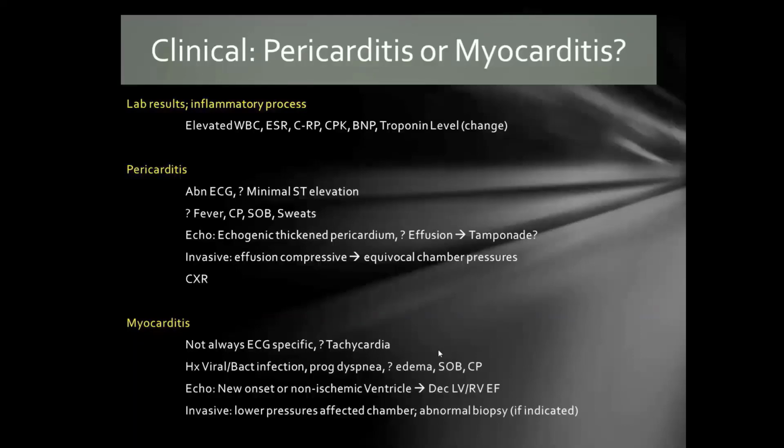And of course, we want to look for effusion, if there's anything in the effusion, debris, and of course, if there's any RV collapse or anything, to look for any signs of tamponade, which of course, as we all know, is more of a clinical presentation. If a patient's about to go into tamponade, there's usually a lot of evidence clinically looking at them. So that's not so hard to pin down sometimes.